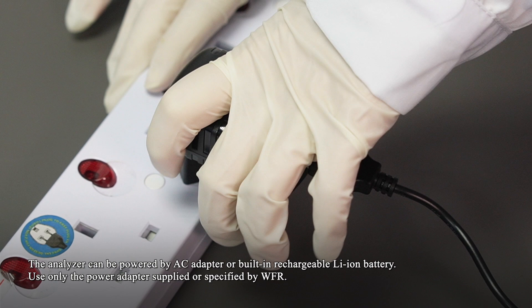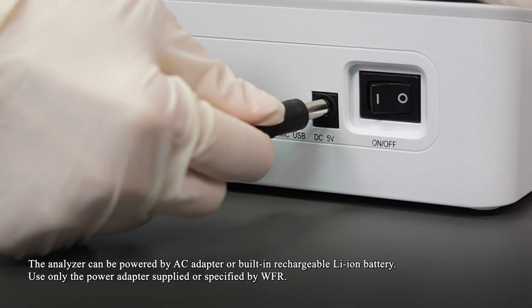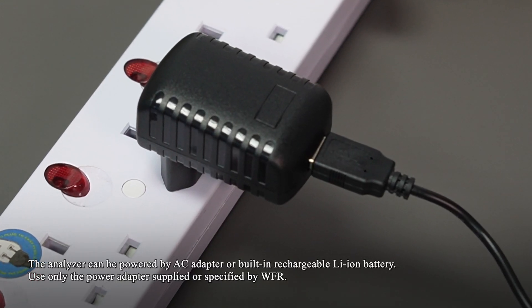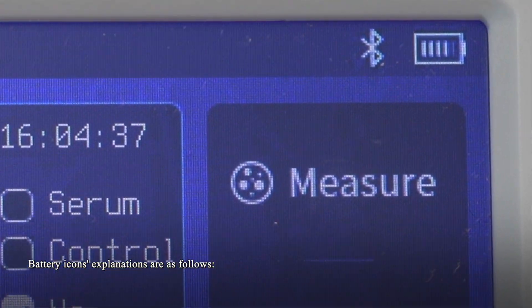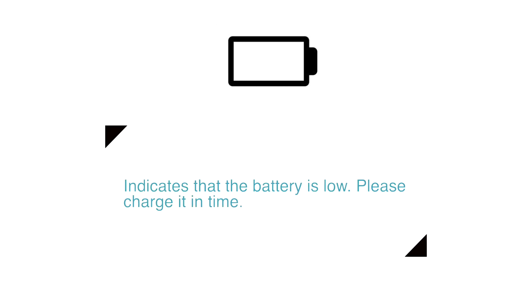The analyzer can be powered by an AC adapter or built-in rechargeable lithium-ion battery. Use only the power adapter supplied or specified by the manufacturer. Battery icon explanations: A solid battery icon indicates the batteries are working correctly; the solid portion represents the current charge level relative to maximum. A low battery icon indicates the battery is low — please charge it in time.